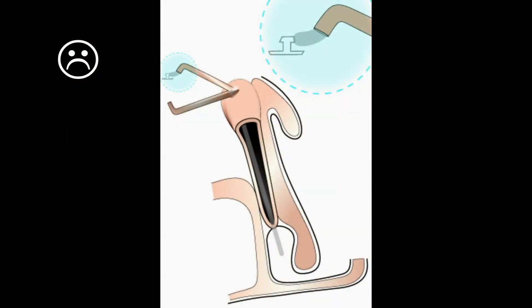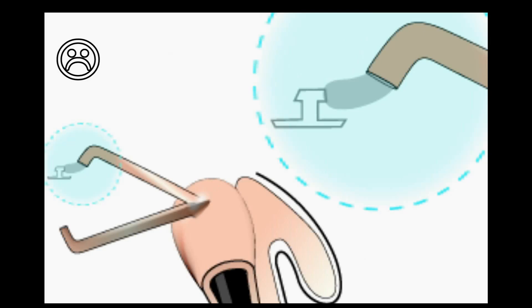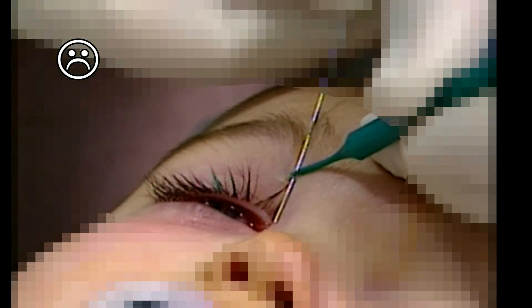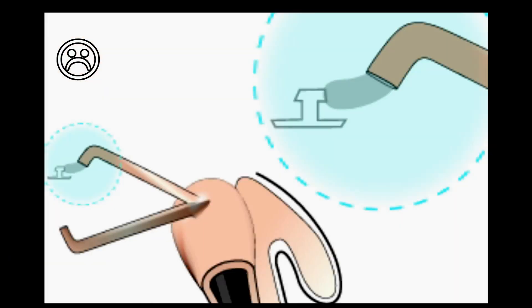If the fixation plug is no longer in contact with the punctum because the stent has come out as the metallic guide is withdrawn, it is necessary to stop and readjust the stent on the guide. The fixation plug is moved up near the guide handle, inserted to the proper position, and then the guide carefully withdrawn.